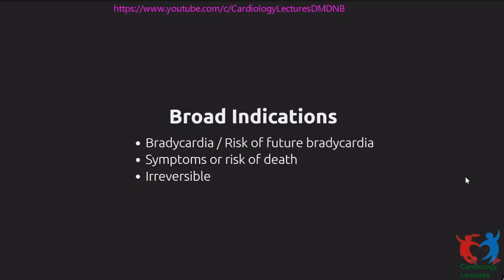So broadly, when you think of indications for pacing, we are going to pace patients who have significant bradycardia, a slow heart rate, or if they don't have bradycardia, they have conduction abnormalities which indicate a risk of future bradycardia. And that is the first essential thing that has to be there before you think of pacing somebody. And you either need to have symptoms, or in a patient who is not symptomatic, the reason for pacing can be to prevent a possible risk of death in the future. So one of these has to be there.